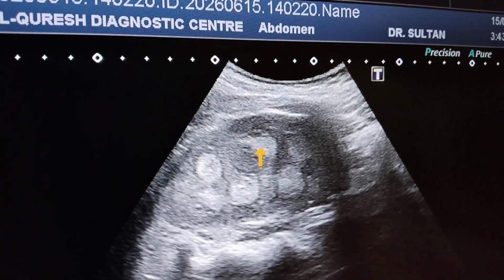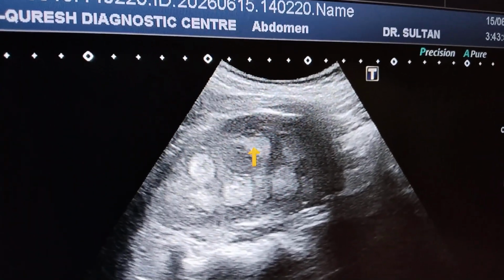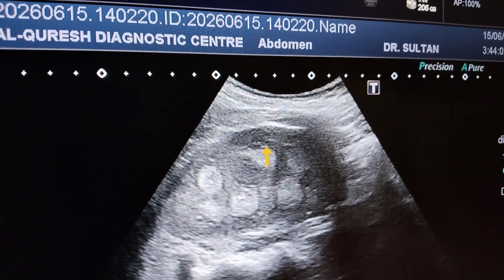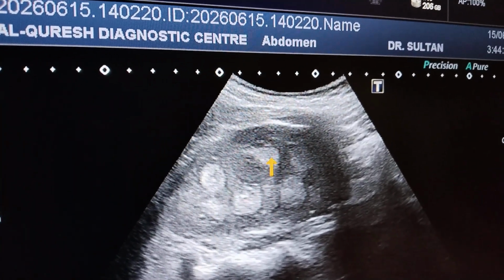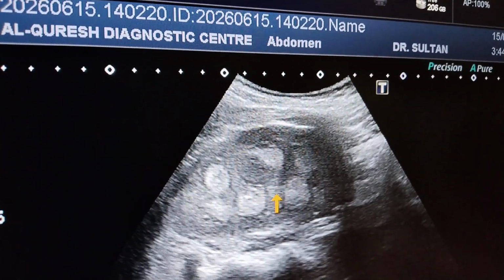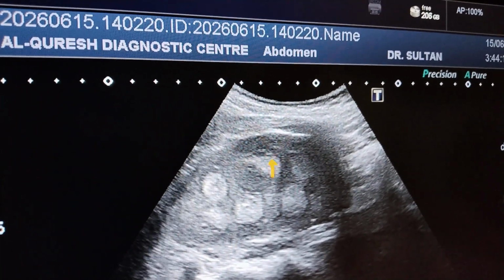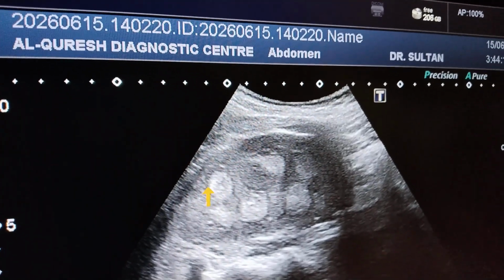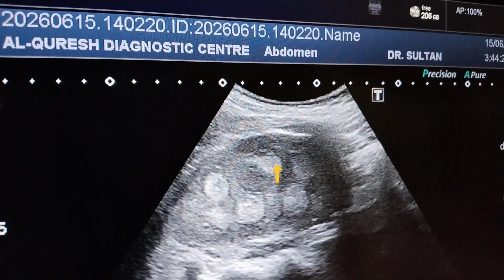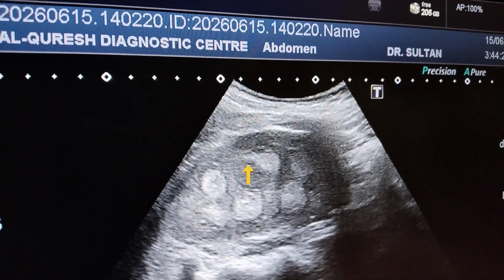तो ये अर्ली जो है, इसको हम कहते हैं मेडुलरी नेफ्रोकैल्सिनोसिस. अब क्या होता है, नॉर्मली ये यूरिन कंसंट्रेट करता है, देन यूरिन गोज़ टू द कलेक्टिंग सिस्टम, कैलिसिस सिस्टम, और इस तरह ये. तो व्हाट इज़ द रीज़न व्हाई दिस बिकम हाइपरइकोइक? This is due to the deposition of calcium salts, mainly oxalate and phosphate होते हैं.